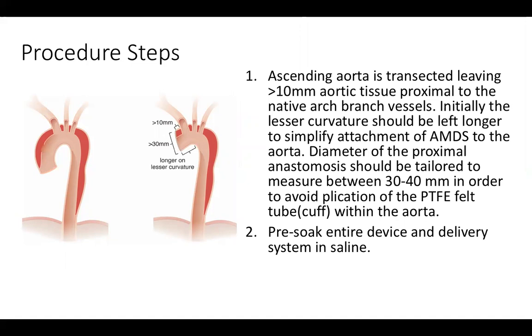We haven't done one yet here. We've had a couple of close candidates, so our goal is to start using this here immediately. As it stands, if I'm here, I've tried to assess every type A dissection for its suitability and candidacy for this stent, because there is a trial involved and we are part of the registry. Essentially with every dissection we have, I speak to Ali, who's the owner, developer and CEO of the company, and ask him his thoughts on using this in the case.